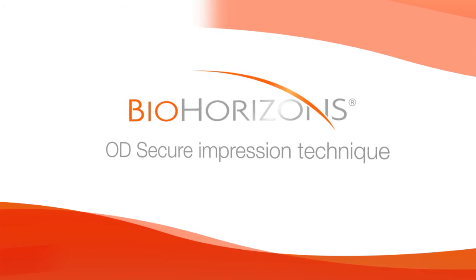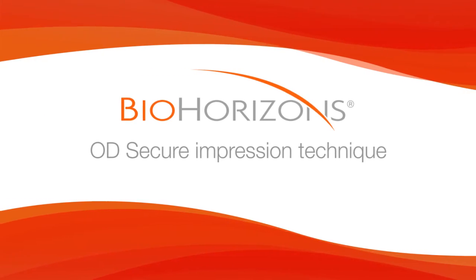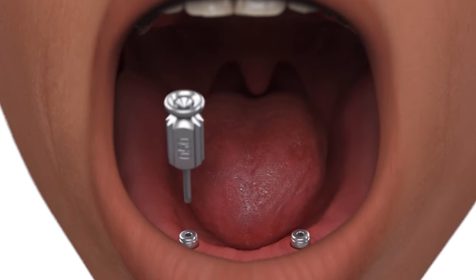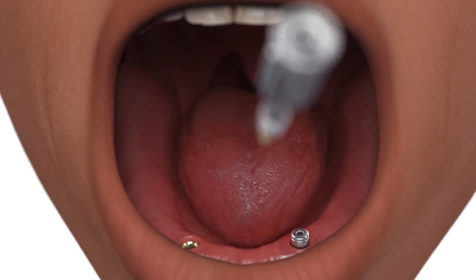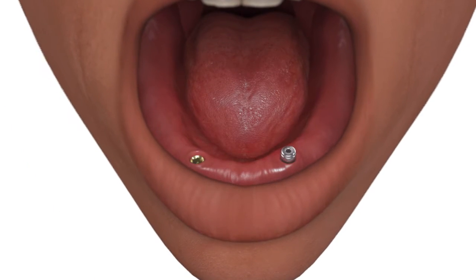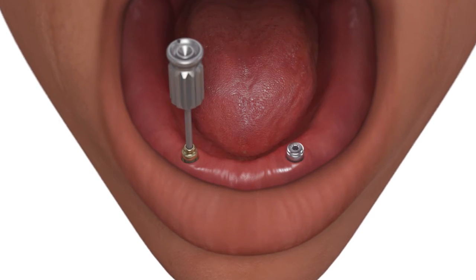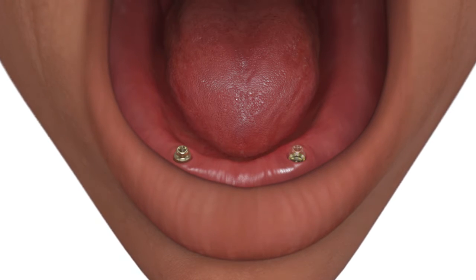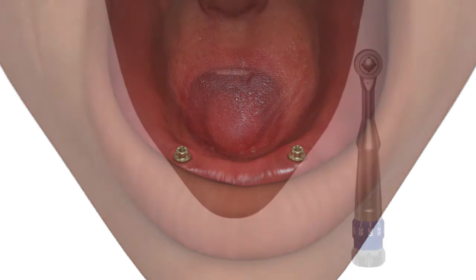OD Secure Impression Technique. Remove the healing abutment and confirm that the prosthetic platform is free of any bone or soft tissue debris. Place the OD Secure abutment onto the implant body using the hex driver and hand tighten. Place each OD Secure abutment immediately after removing the healing abutment to prevent soft tissue from collapsing over the implant.